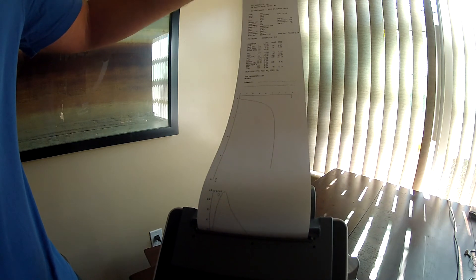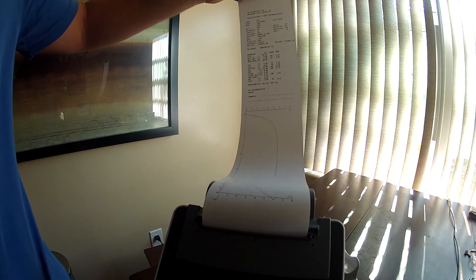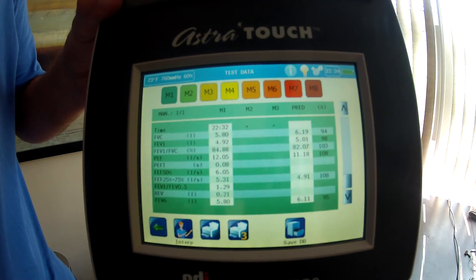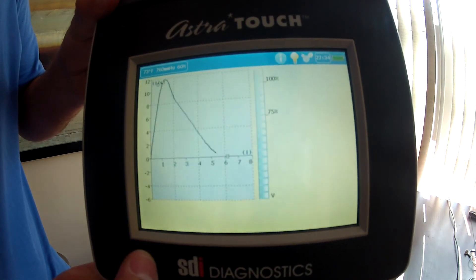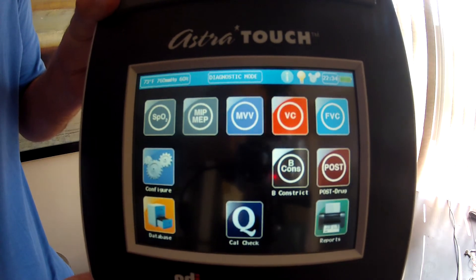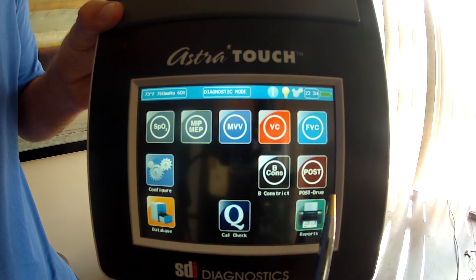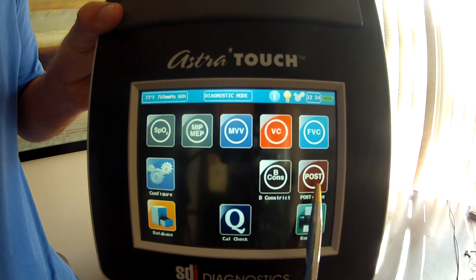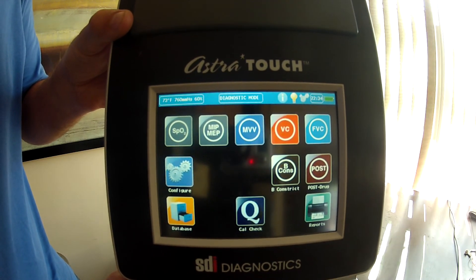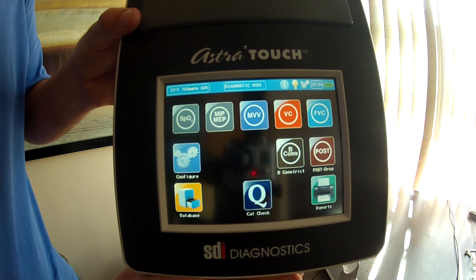It will interface with every EMR out there via a PDF file. When you're done, you just go back to the screen to see the result again, then go back to the home menu. If you want to do a pre and post bronchodilator challenge, after you've done the first FVC screen you can push the post button to move on to that. I hope that answers all your questions — that's it for my demonstration. Please feel free to contact SDI if you have any more questions.